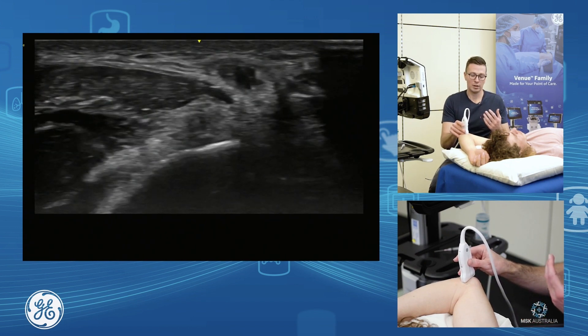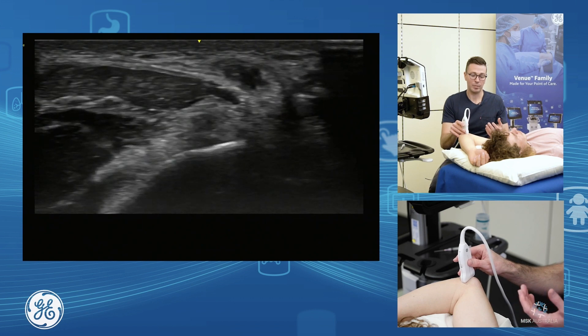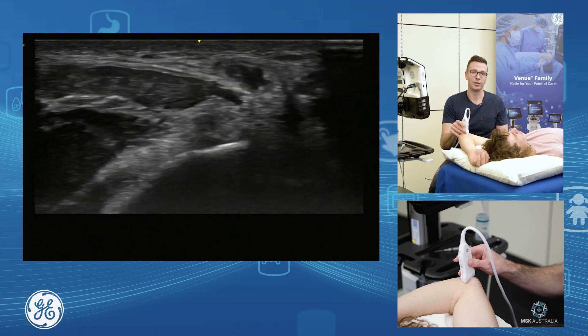Ulnar nerve, FCU, and ulnar collateral ligament assessment.